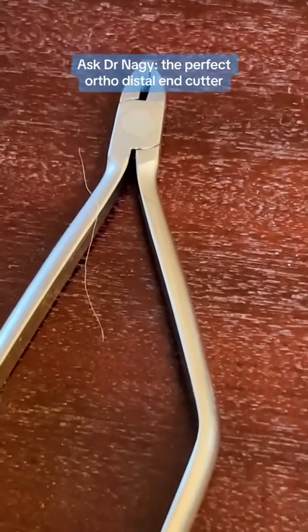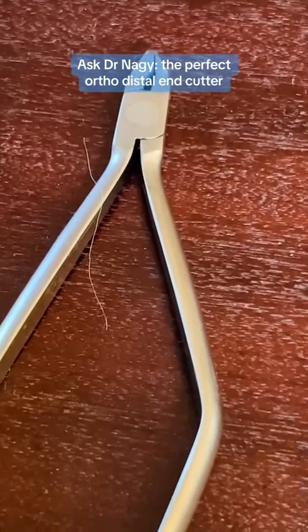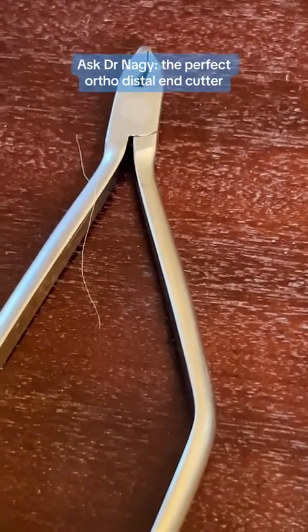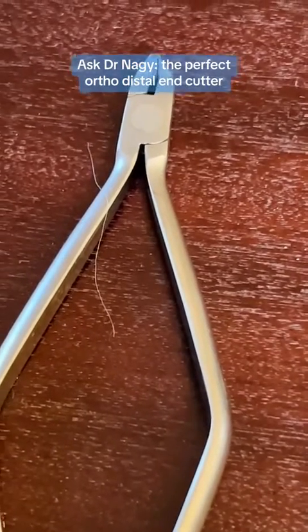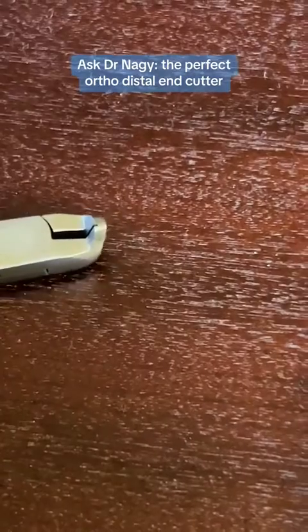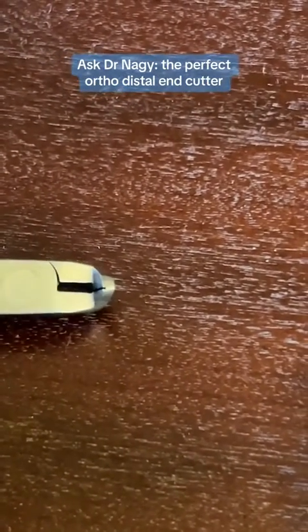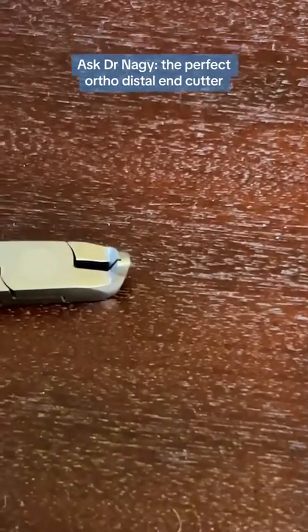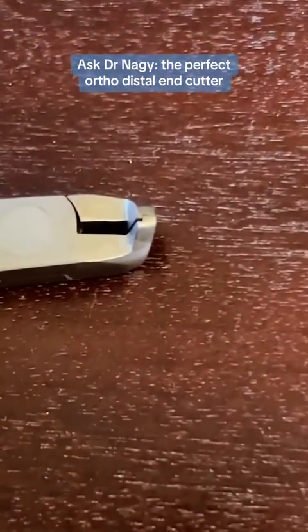So let's look at some distal end cutters. I've been on a mission to find the perfect distal end cutter for about 15 years. The most ideal distal end cutter is going to cut the wire flush, and it's also going to hold the wire. Here's one distal end cutter that has kind of a compact head — that's really nice because you want the distal end cutter to have a compact head so you can get around the wire.